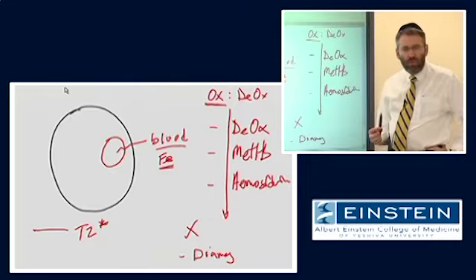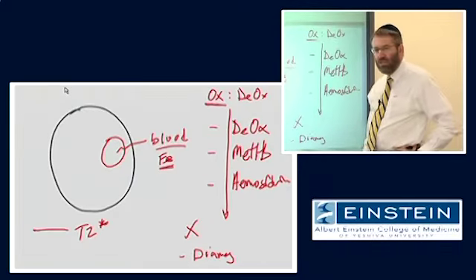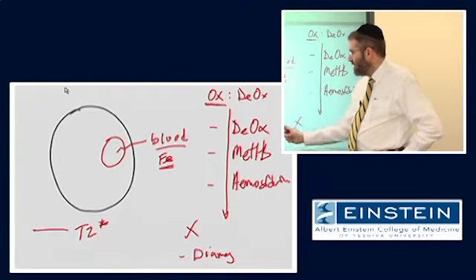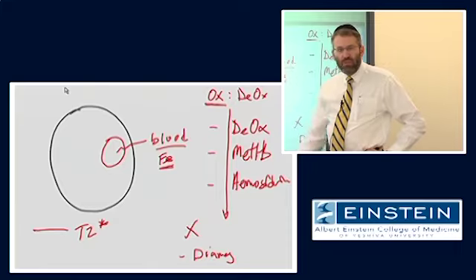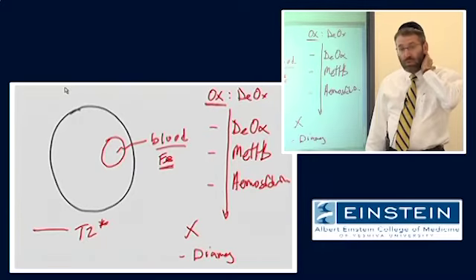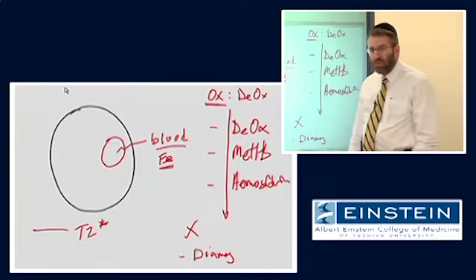So if you want to make your image sensitive to the presence of deoxygenated hemoglobin, for example, you want to use an image that is maximally sensitive to T2 star differences, such as a gradient echo image. A spin echo, or especially a fast spin echo image, is going to be much less sensitive to these effects.